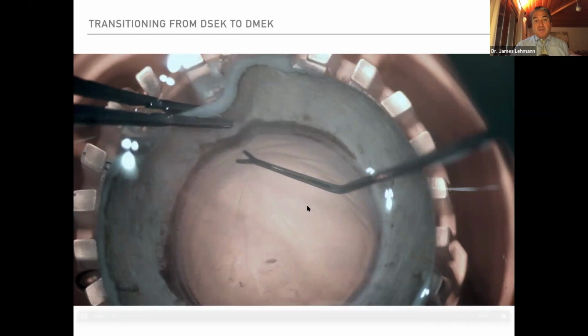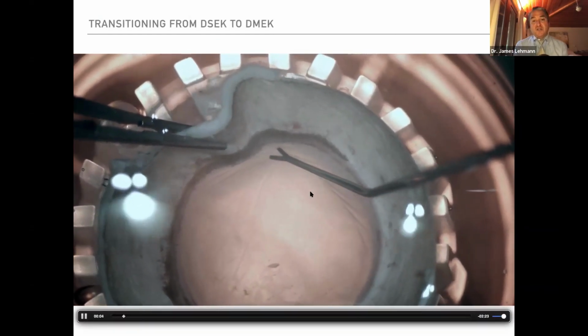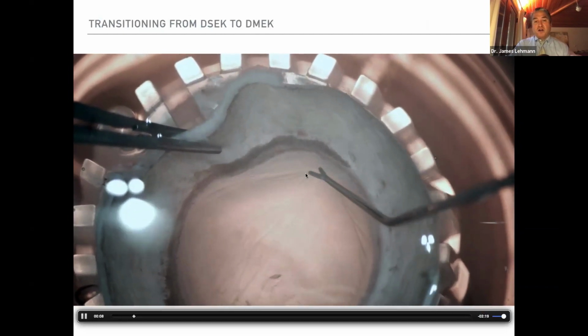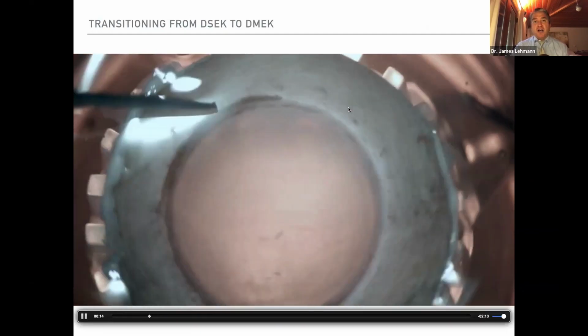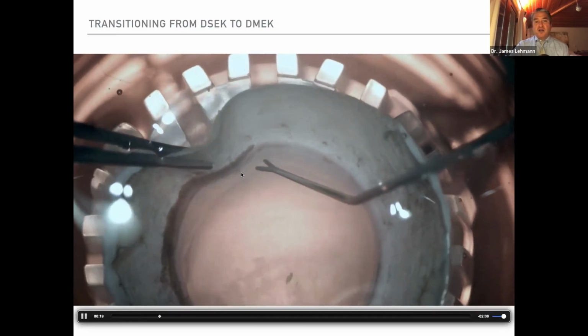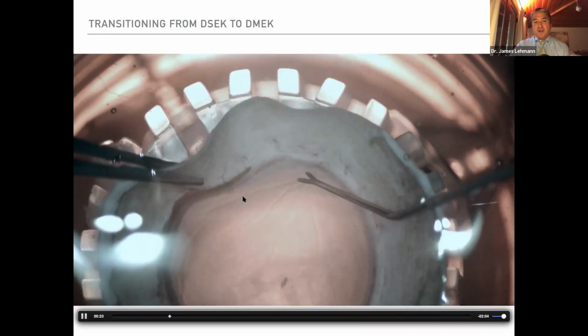And so a little bit more on the preparation. This is the technique that I still use. And you start by using what's called a Beckert Y hook. Now, what is it sitting in here? Well, this is a viewing chamber, so a plastic viewing chamber under an operating microscope in Optisol. And what you're trying to do here is go about 1 millimeter inside of the limbus where you have a clear zone, and you're scoring.